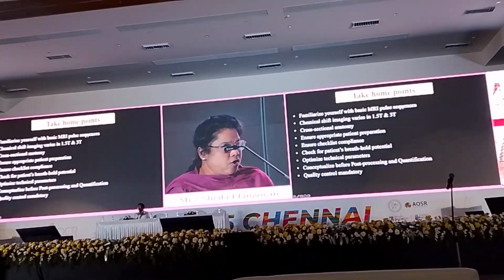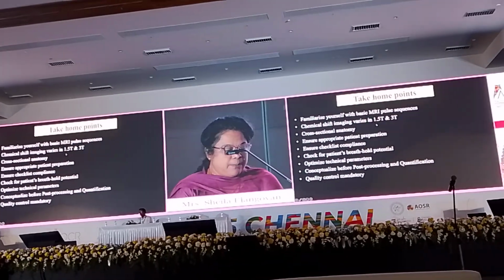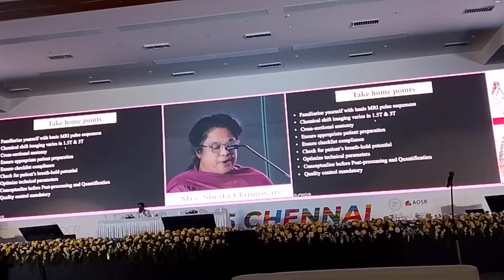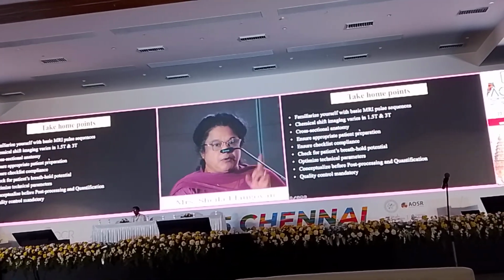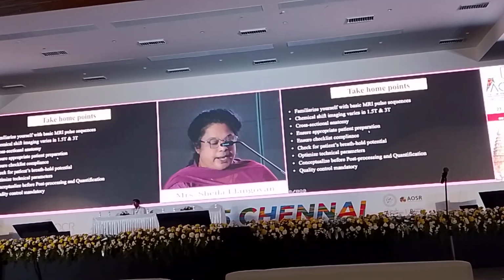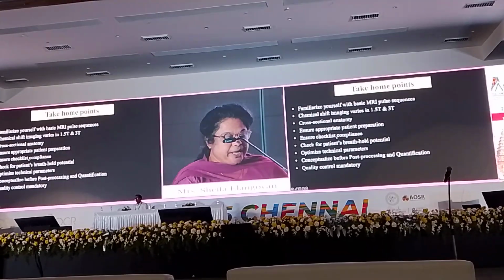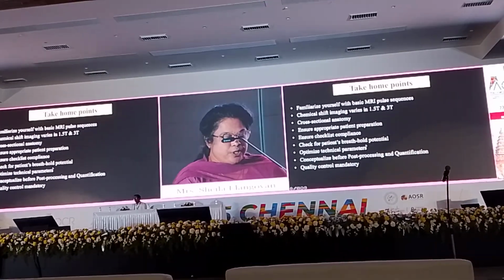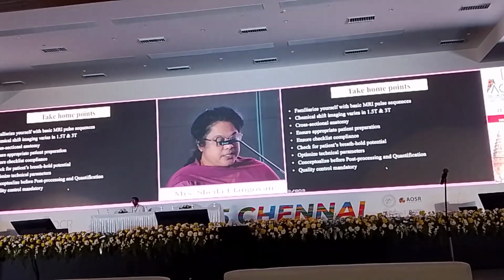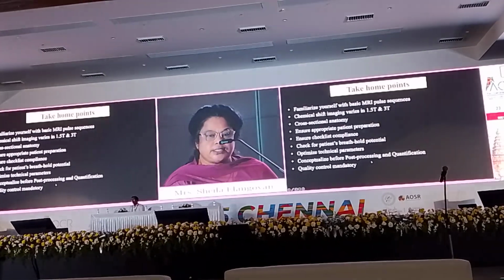Okay? So the take-home points are: familiarize yourself with the basic pulse sequences. Chemical shift imaging exploits the difference in the precession frequency of fat and water. See whether you're working on a 1.5 T MRI or 3 T MRI. You should be aware of the cross-sectional anatomy, familiarize yourself with that. Then ensure appropriate patient preparation, ensure checklist compliance, check the patient's breath-hold capacity, optimize the technical parameters and know how to do post-processing, and quality control is definitely mandatory.